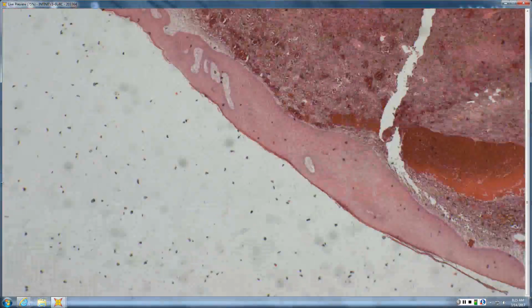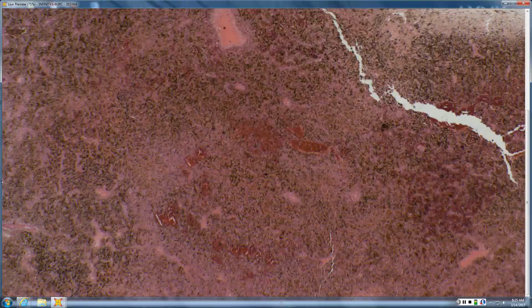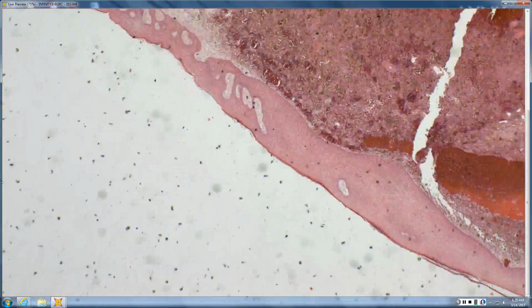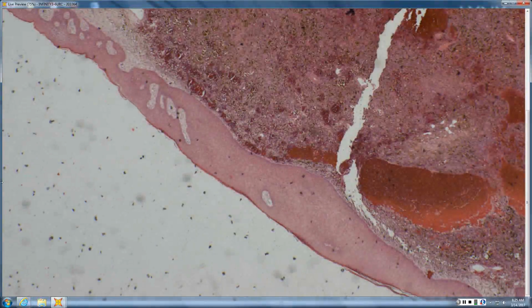Okay, how about this one? Aneurysmal DF. So, how'd you jump right to that with this big black, I would have thought melanoma, right? You'd be wrong. Don't let that brown fool you. Why should I not go down the road of melanoma for this big brown nodule?